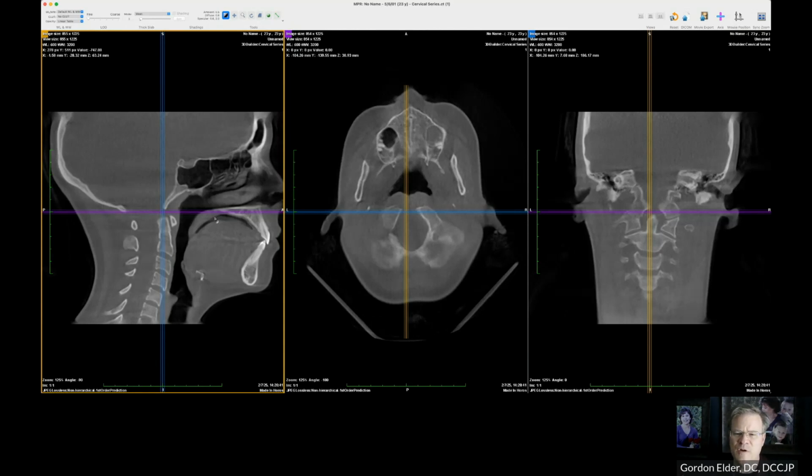And then we'll move the back brace up to wherever one point touches their head or their upper back or whatever. Then we'll use a Velcro strap that goes around. That's my particular machine, so we're fitting them to the machine. That means that their head's going to be tilted a little bit. You can see that her head is tilted a little bit to the right. It's going to be rotated a little bit, maybe inclined or declined.